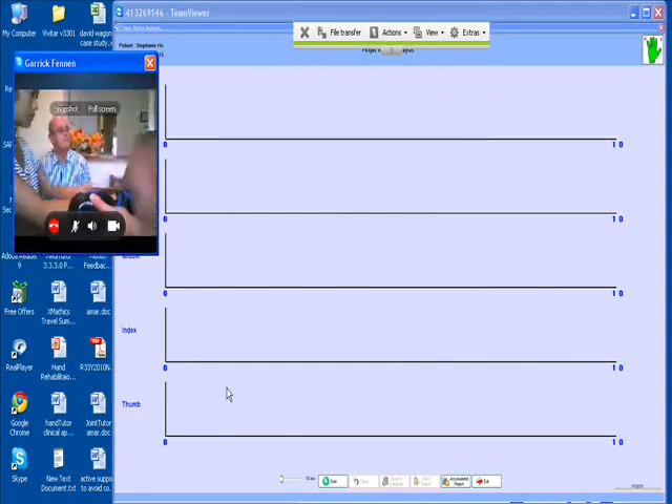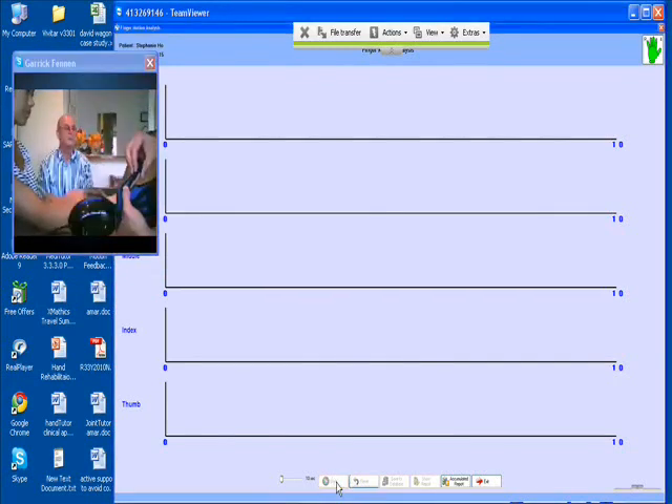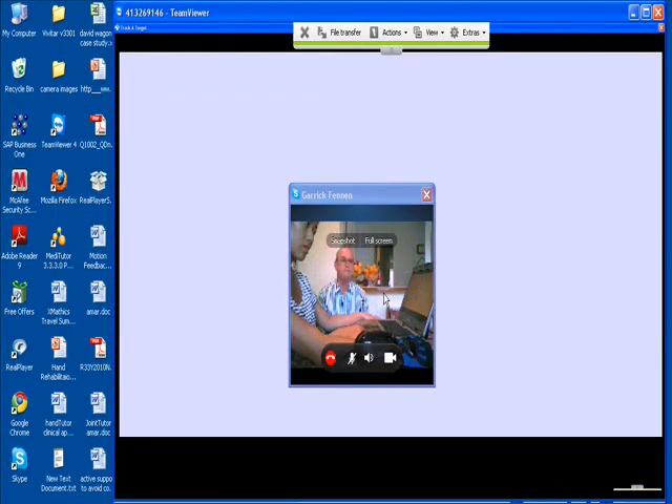What Stephanie is going to have to do here is make a fist and open a fist as much as she can. I'm going to run this for 10 seconds — just a couple of cycles. You're going to see a line, and you're going to have to make the line go down and then make the line go up. Okay, and that's it — thanks a lot.